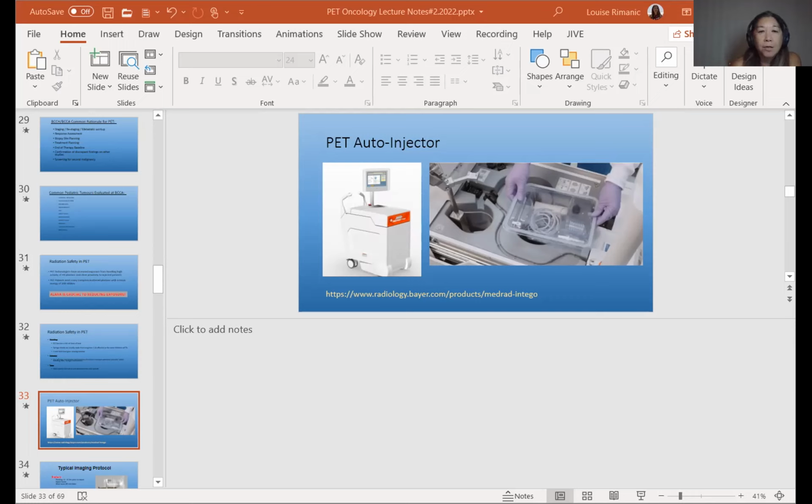And then another potential application would be for monitoring systemic treatment in patients with metastatic prostate cancer. So looking for bone mets. So a similar application as how we use FDG, but remember that prostate cancer is not particularly FDG avid, but perhaps we can use gallium-68 PSMA instead.